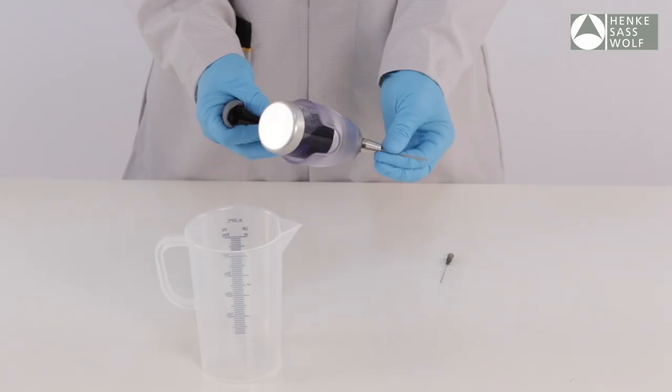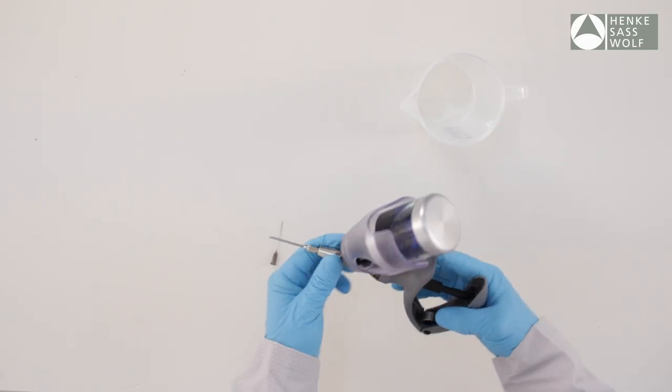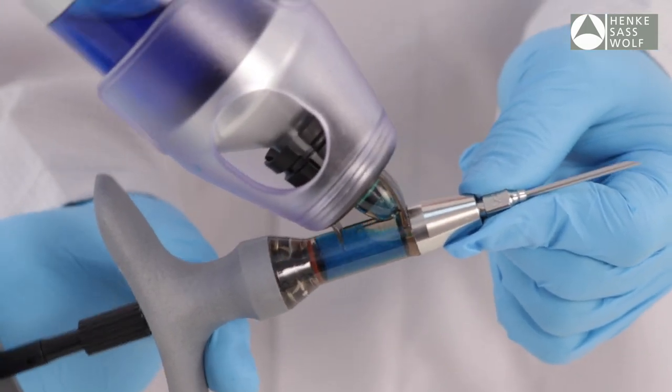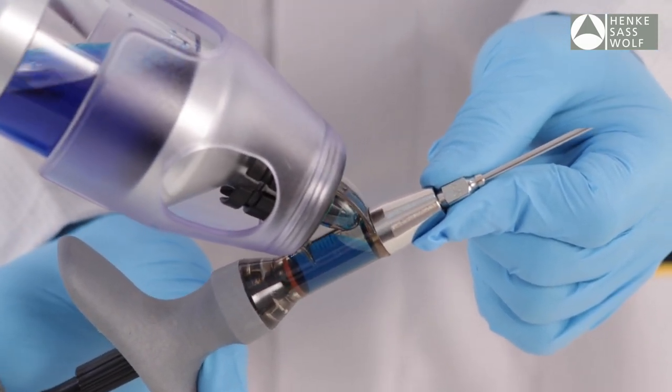Insert needle onto luer lock fitting and secure the needle clockwise. In order to prime your syringe, hold the Ecomatic at a slight incline.